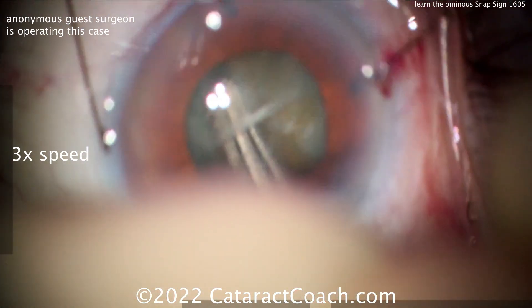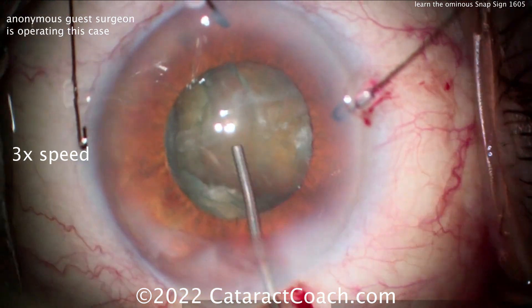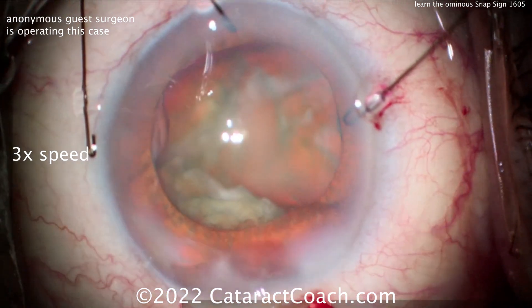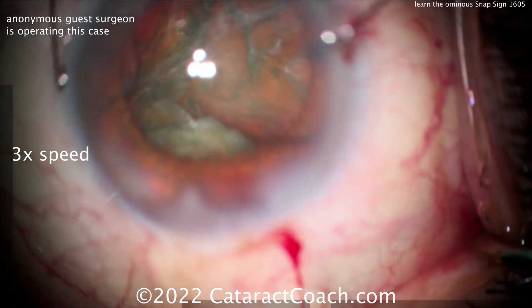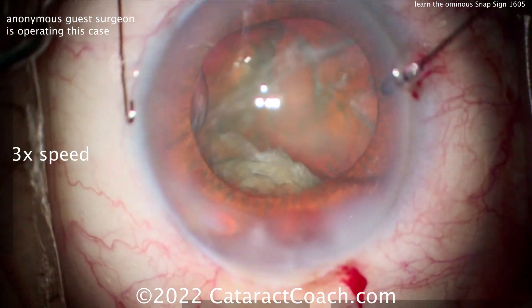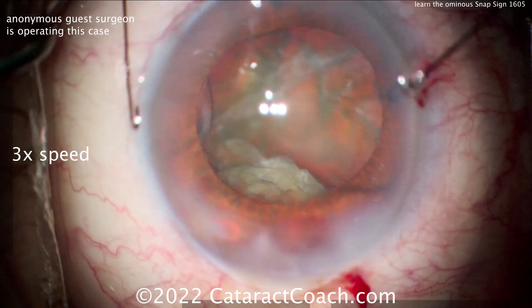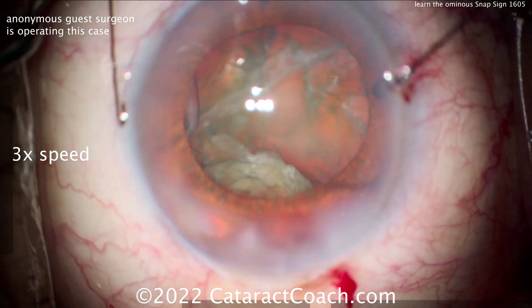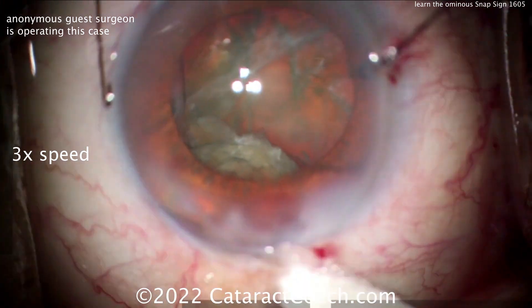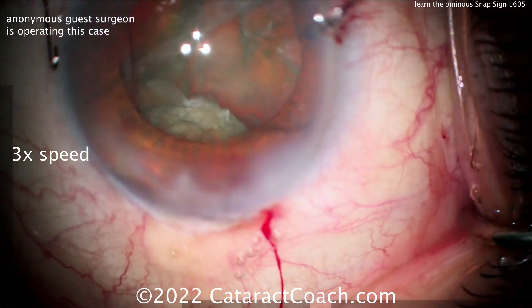Bring the nucleus up out of the capsular bag into the anterior chamber, abandon the corneal incision, make a new scleral incision, and get the nucleus out of the eye if you can. It's just too deep — you can see that big gap, that big clear red reflex at the top of your screen. That just tells you it's way far gone. That nucleus is already falling into the mid-vitreous. As soon as the infusion pressure goes into the phaco probe, that infusion pressure is going to cause that extra push and that whole nucleus is going to go right back into the vitreous cavity.